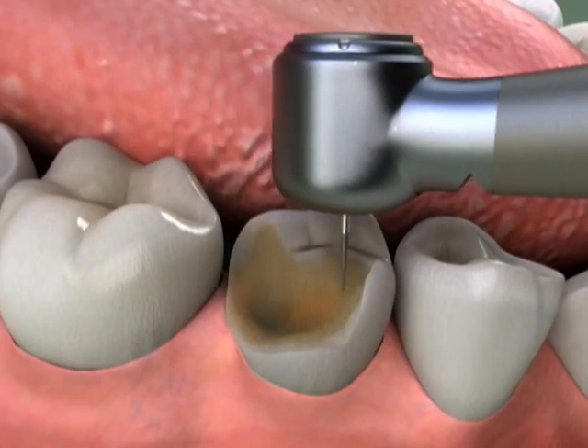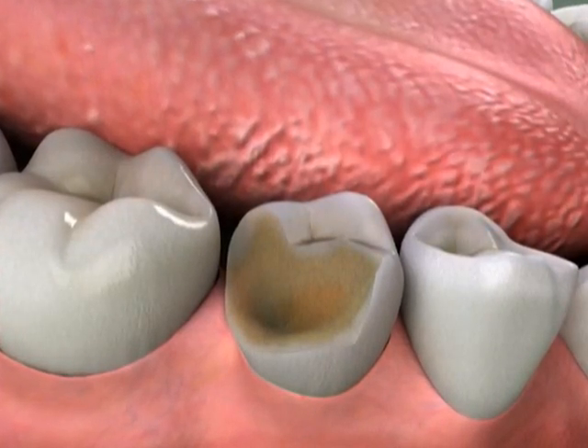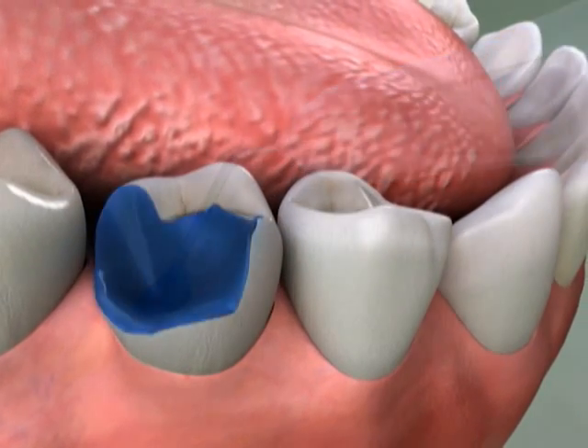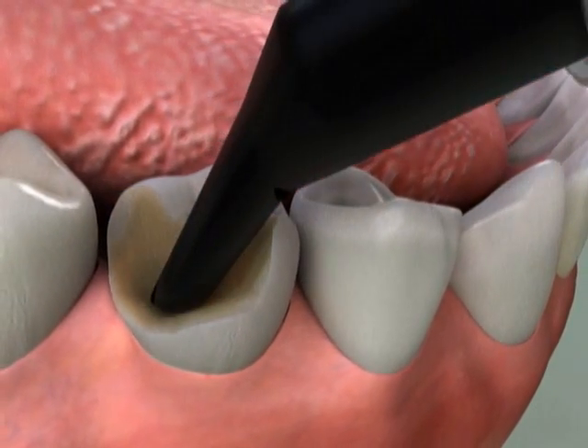The first step is making sure the tooth is free of decay. We prepare the tooth for the buildup by applying a mild solution, and then we carefully place the resin material.